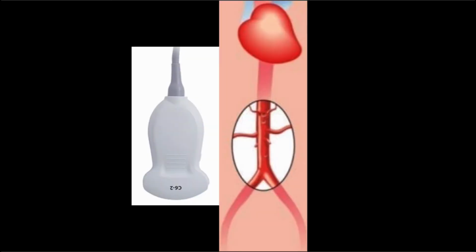On physical exam, the pulsatile mass was not very impressive, yet Dr. Dugan astutely grabbed the ultrasound machine and decided to look at the patient's aorta, given his pain complaints and the inability to ignore the large X marked on the patient's abdomen.